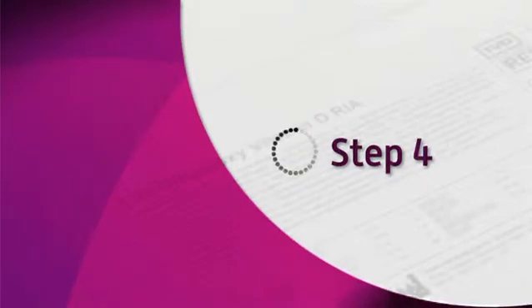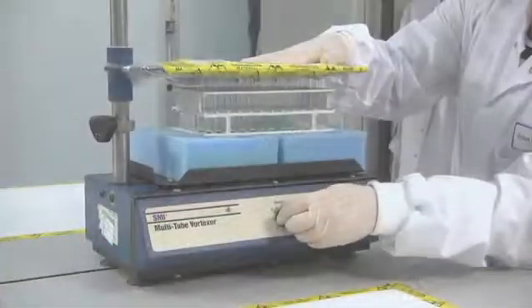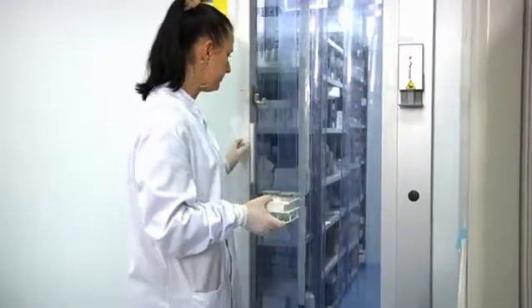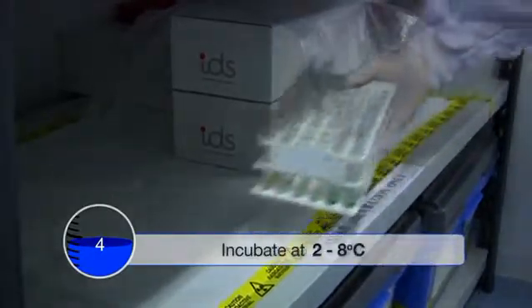Step 4: Vortex all tubes and incubate between 2 and 8 degrees Celsius for 16 to 18 hours.